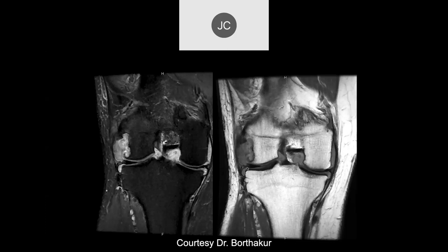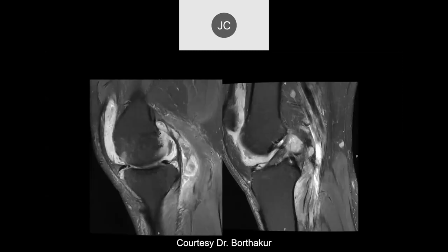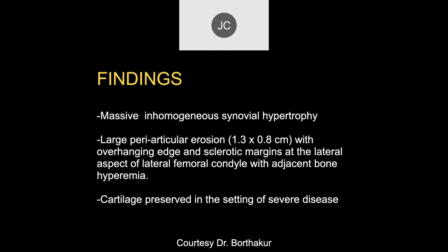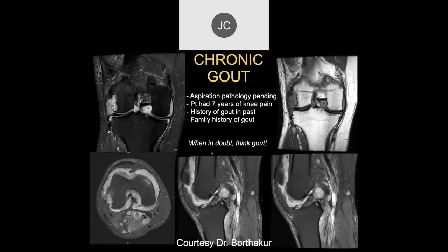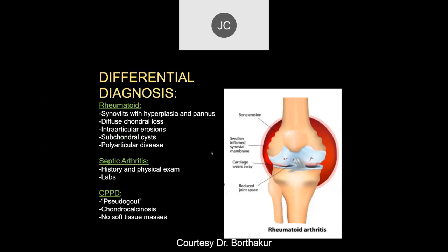A case of chronic gout shows a large erosion at the lateral femoral condyle with heterogeneous soft tissue filling the joint space and extensive synovial thickening. It is important to treat gout to prevent reaching this chronic stage where everything starts eroding.